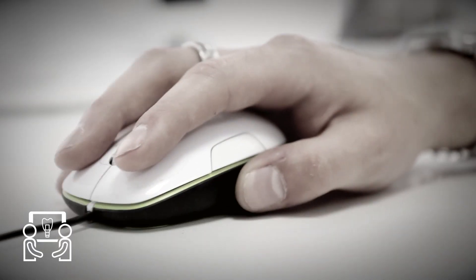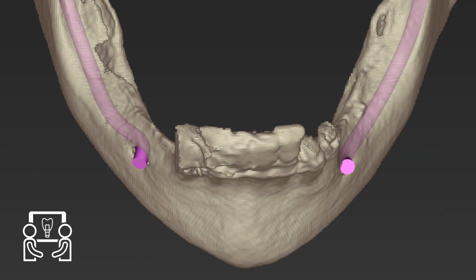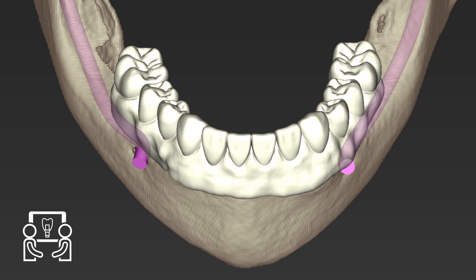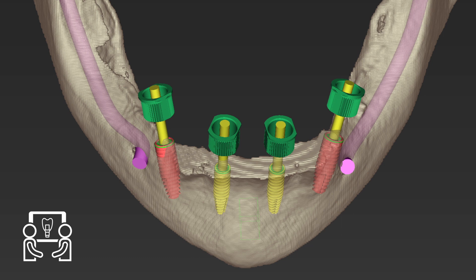Planning. The STL file and the DICOM file are merged into the coDiagnostiX software, which allows digital implant planning and design of the surgical template.